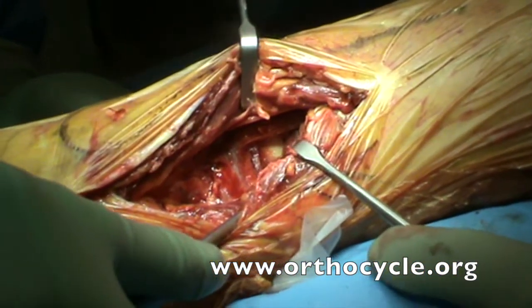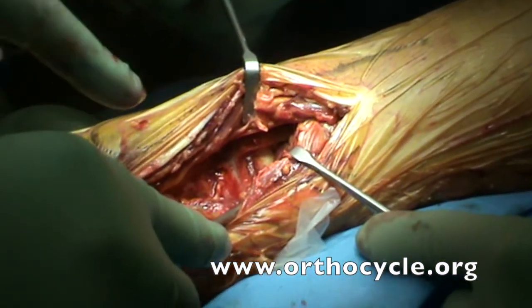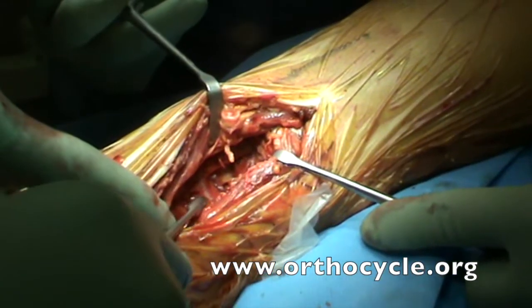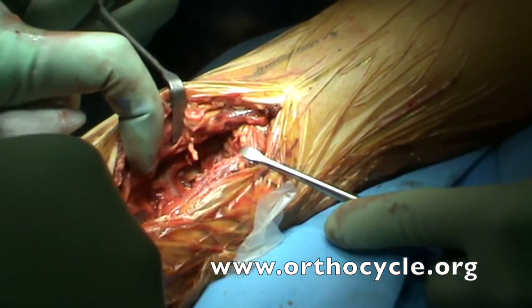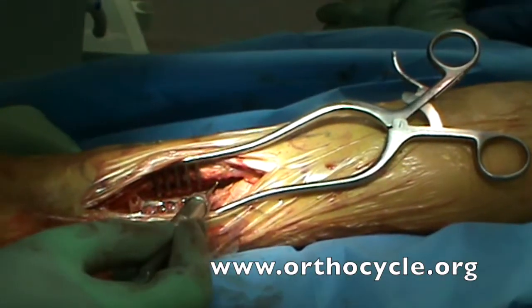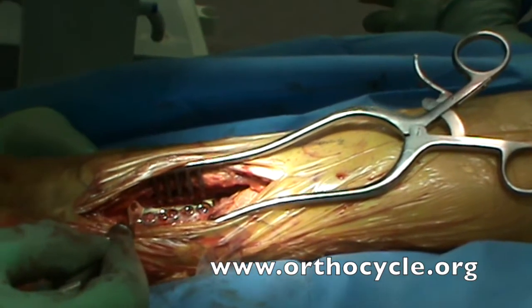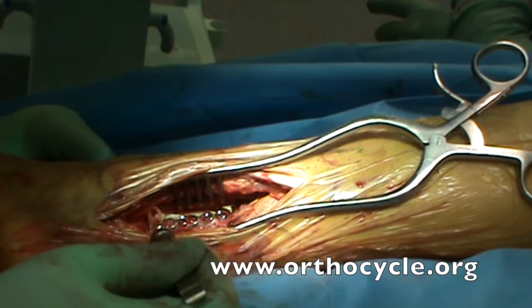This is another patient with a posterolateral approach. We can see the FHL being retracted posteriorly. At the top of the wound we can see the shaft of the tibia which has been denuded. There's actually a large vein running across this specimen which is going to have to be divided. The posterior malleolus — we're going to leave the periosteum intact so as not to devitalise it and because it's comminuted underneath. The vein has now been divided. We can see the plate which has been attached to the back surface of the tibia, acting as a buttress to push the posterior malleolus fragment inferiorly and anteriorly to line up with the rest of the joint.